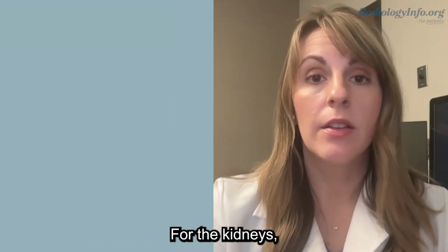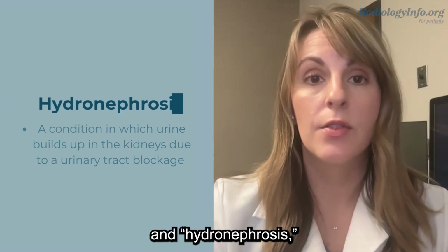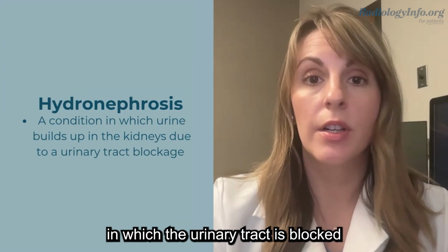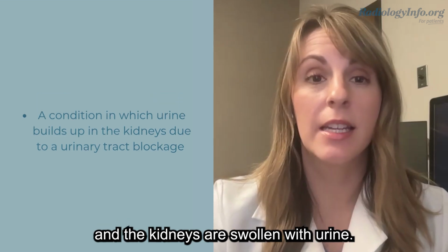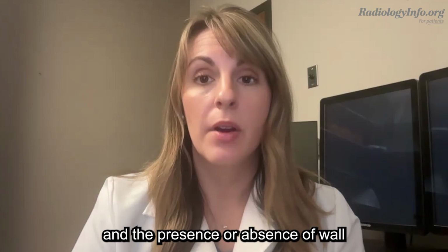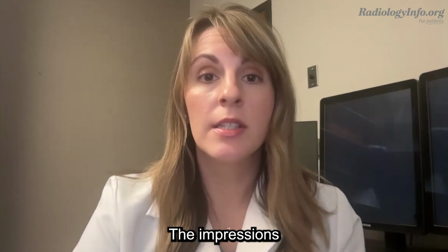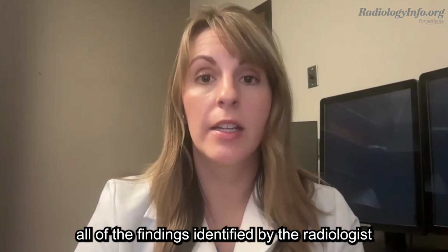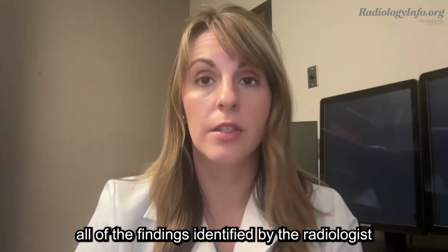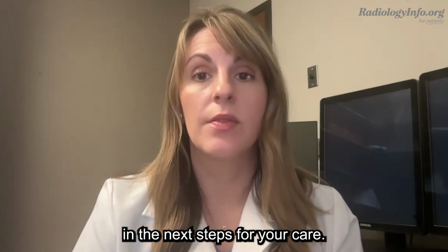For the kidneys, the radiologist may describe the presence or absence of kidney stones and hydronephrosis, a condition in which the urinary tract is blocked and the kidneys are swollen with urine. The urinary bladder may also be evaluated, and the presence or absence of wall thickening or debris may be mentioned. The impression section summarizes all of the findings identified by the radiologist to help guide your doctor or healthcare provider in the next best steps for your care.